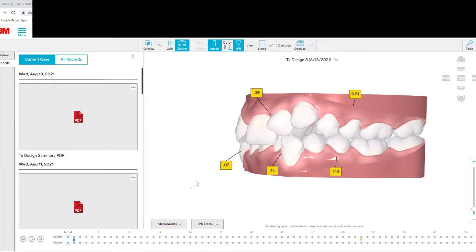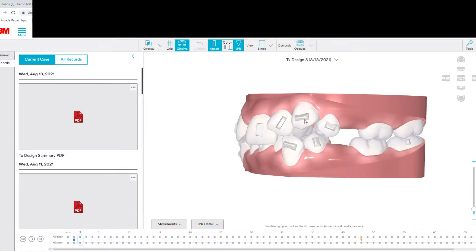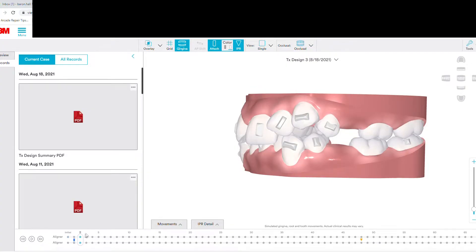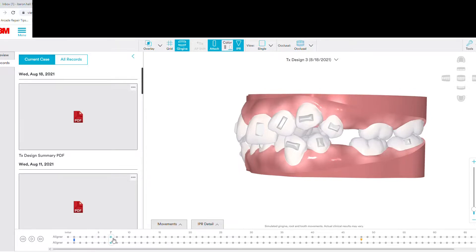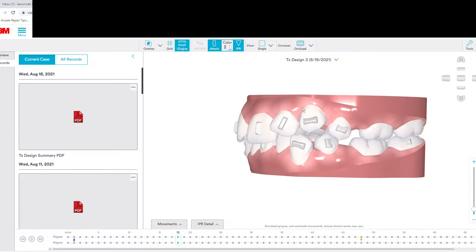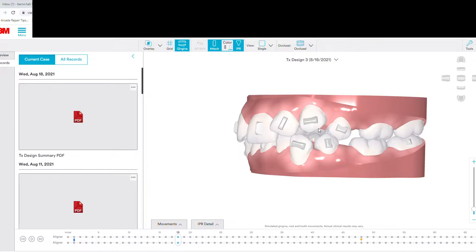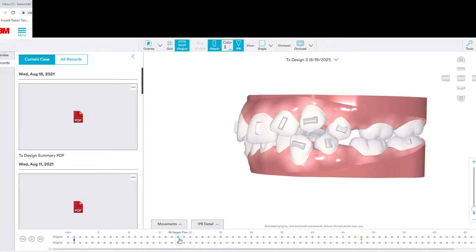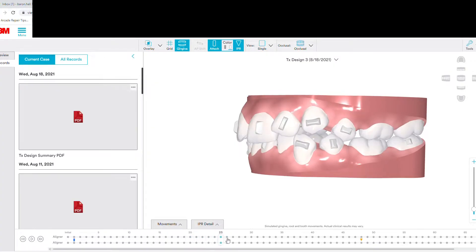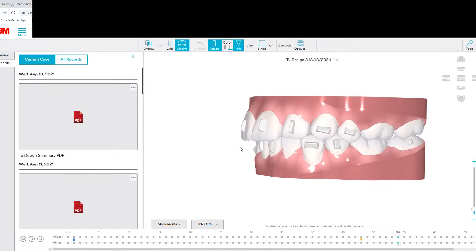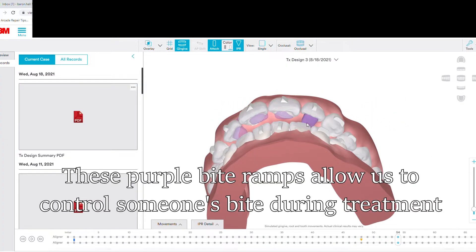Going back to our particular case, you can see these teeth right here need a lot of movement — they need to move down and backwards. So those attachments are there to help guide that movement; they are absolutely essential. Some aligner systems out there brag that you don't need attachments, but that is absolutely false. There's a reason some of those systems are going bankrupt right now. Invisalign and 3M Clarity software, though, are not going bankrupt because they use attachments and they are awesome.